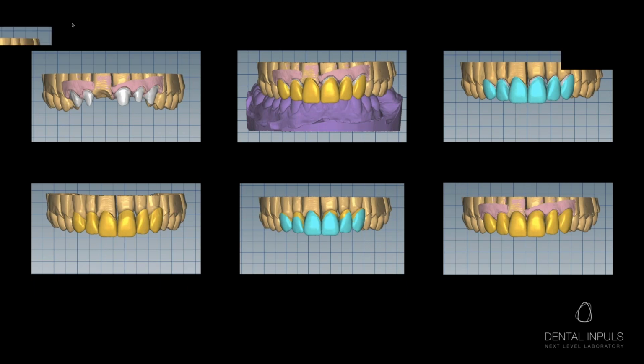So first, we turn off visibility of everything but the setting of the tooth model. Second, we export it as an STL file. So you right-click on the save icon, export scene to mesh, and save visible objects only.